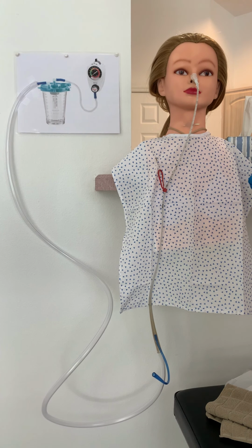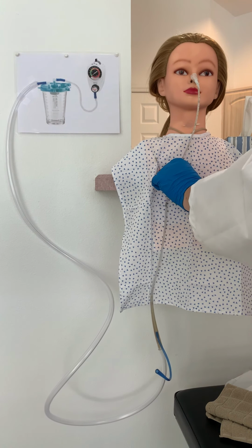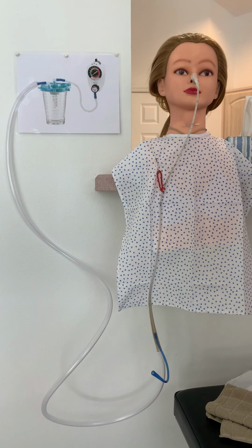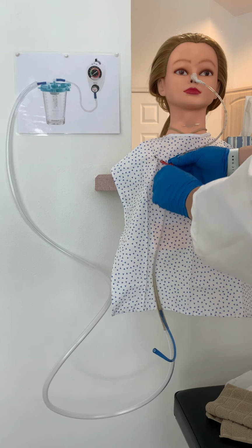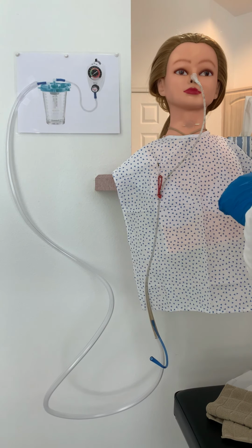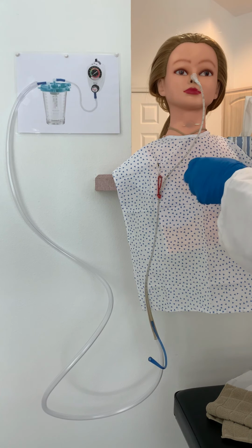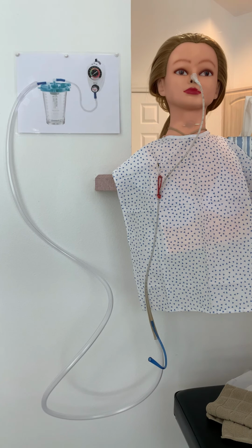And then, Mrs. Harper, I just want to let you know this tube can easily be pulled. So be really careful when you're rolling over or changing positions. Make sure you take note of where that tube is. We want to make sure this is loose enough that it's not pulling. So yeah, just be really careful, because that tube could get pulled out if you end up rolling over on it or anything. So just be cautious that way.